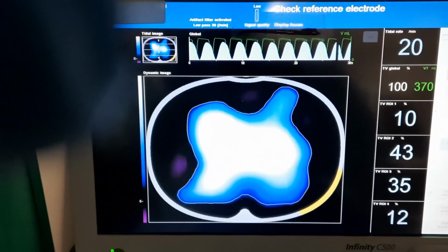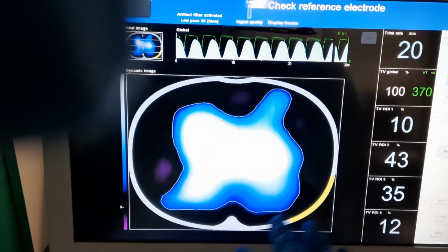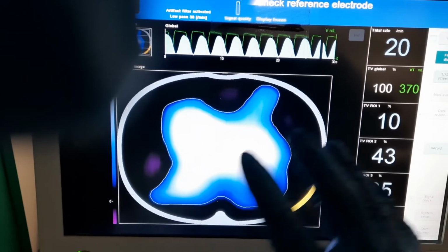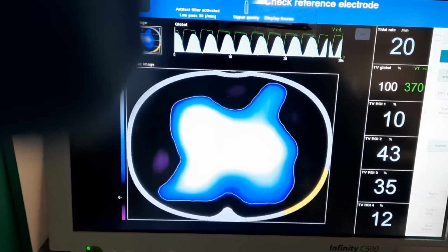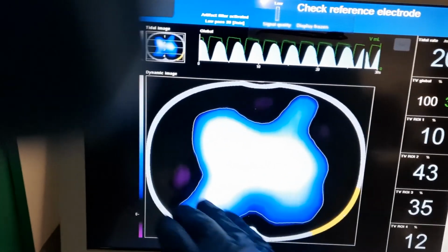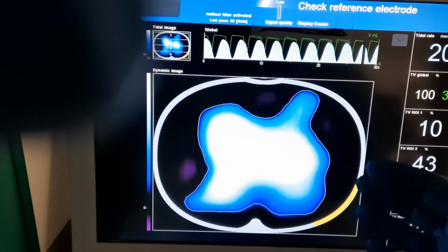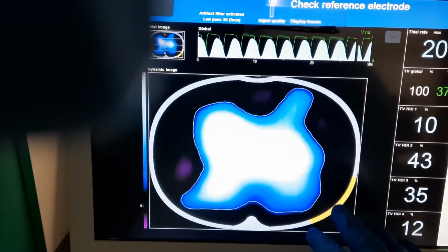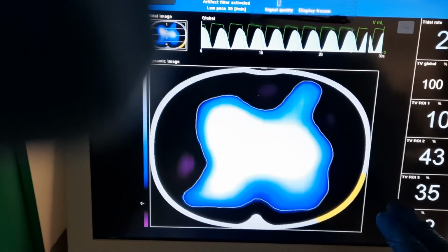Okay, so yesterday we had a tomography when the patient was on their back due to an extremely distended colon on a CT scan yesterday. There was distribution in the ventral and mid-ventral areas, but there was none at the dorsal area. So we put the patient in a prone position, and this is what we see this morning.